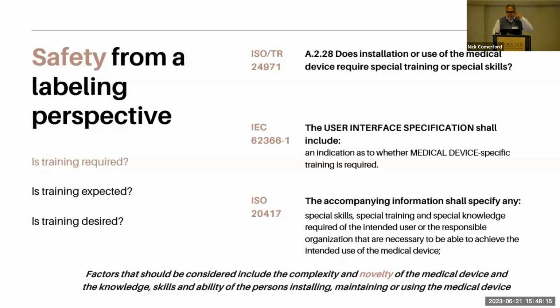Now, the last sentence on there gets more into the digital aspect of things. As you start looking at some of these digital tools, the novelty of it, in the sense that I have a medical device, I now have connectivity, I now have this app, I'm now implementing some AI algorithm, I'm now implementing something from an augmented reality perspective.